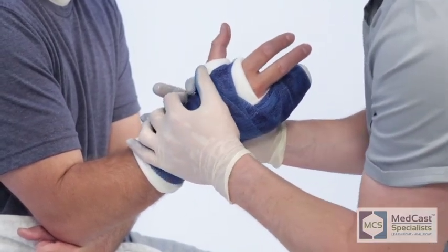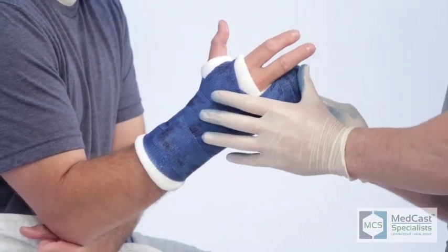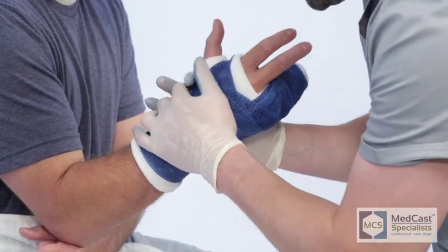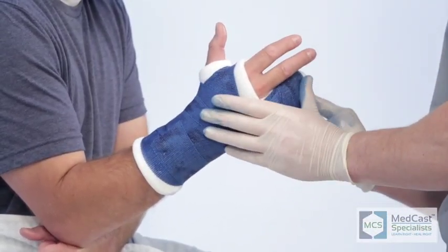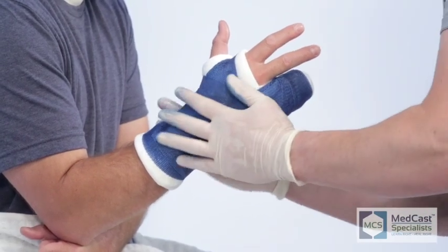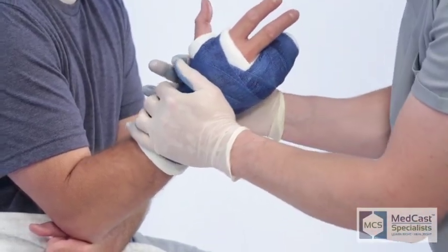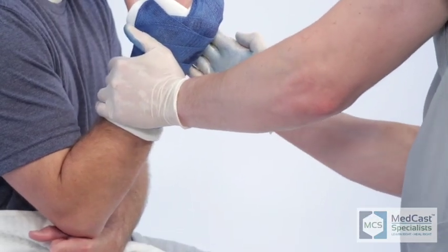As we emphasized on the radial gutter cast, he didn't get his cast material very wet — he just lightly dunked it in the water so it wouldn't dry up on him and become a dead roll before he was finished. For your first time putting on one of these ulnar gutters or radial gutters, just barely even get it wet. That gives you adequate time to navigate through the web space and figure out where you're going before the fiberglass starts to harden and cure.